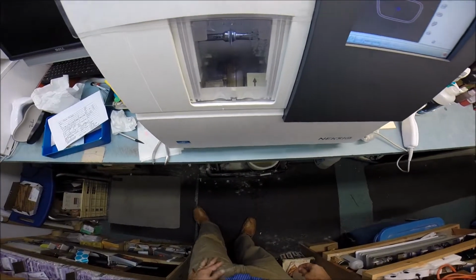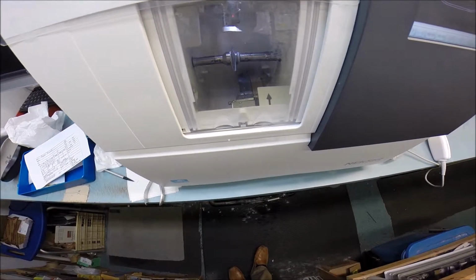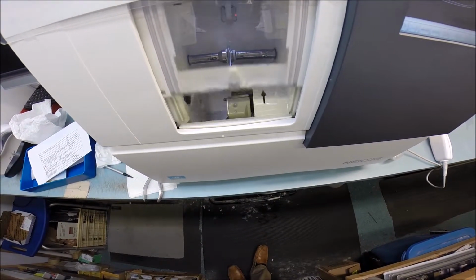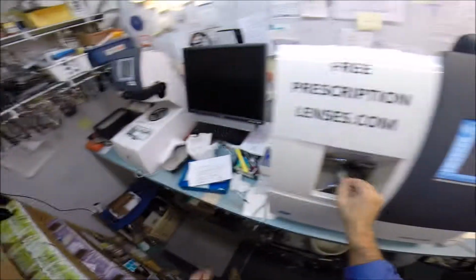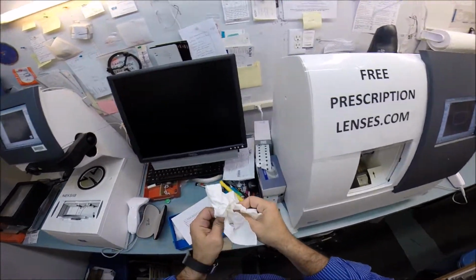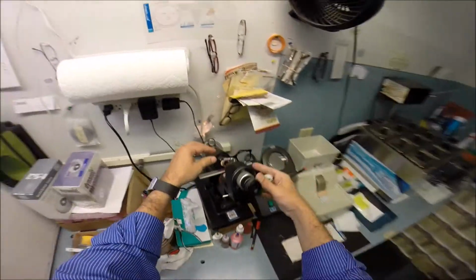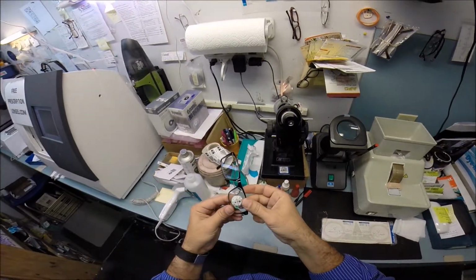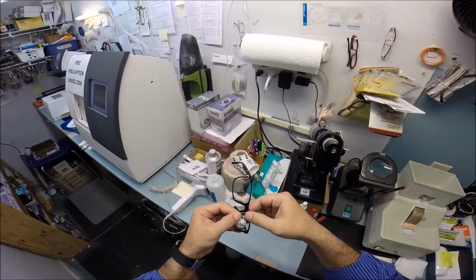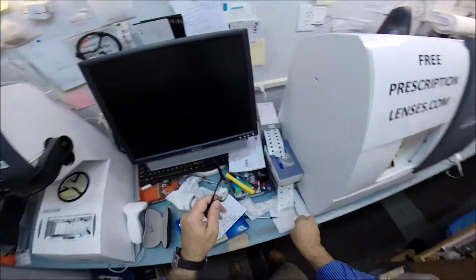Okay, so your left lens is just about done. The door will open. I will hit this button to open the chuck. Thank you, Chuck. Take the magnet out that's holding it in place. Dry your lens off. Where's your frame? Over in my trusty Marco 101 lensometer. So, tuck it in at the outside corner first, then using my thumbs, press down at the nose, it snaps in. Let's take this block off.